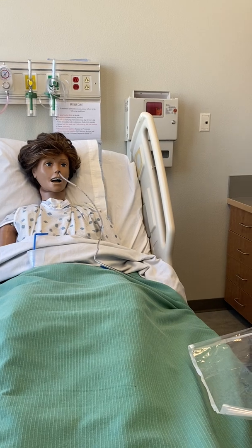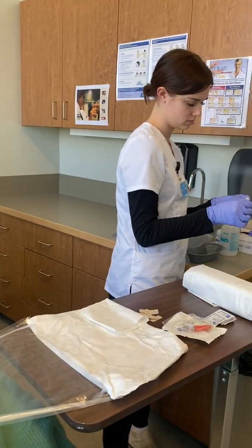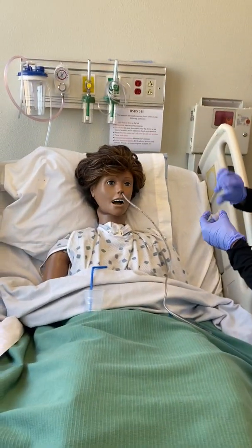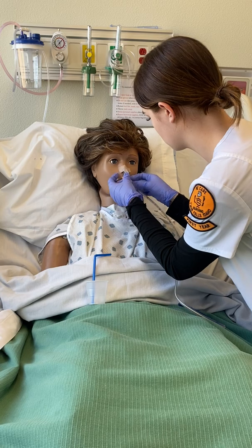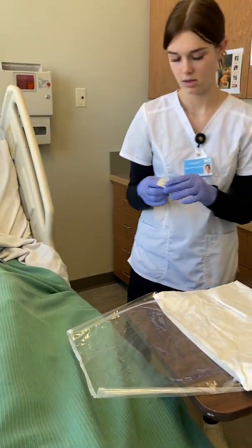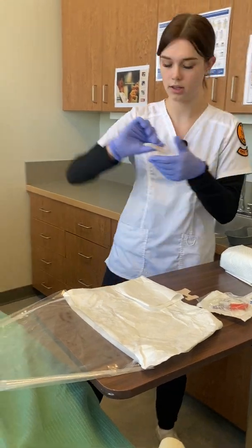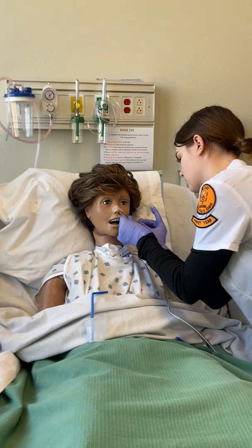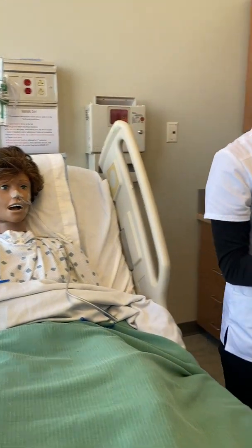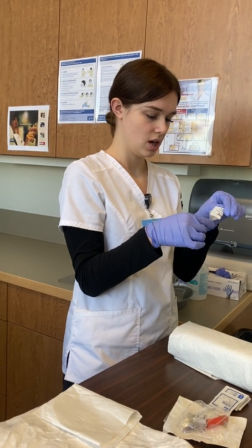We're gonna go ahead and just secure this to your face. Did a great job. No, it's a very uncomfortable procedure. We're just gonna go ahead and fasten this to your cheek as well. Just gonna make it so it doesn't pull on anything. And then I'm going to fasten it to your gown as well. So if you get up at all, just be careful. But this will just keep it from pulling and getting caught on things.